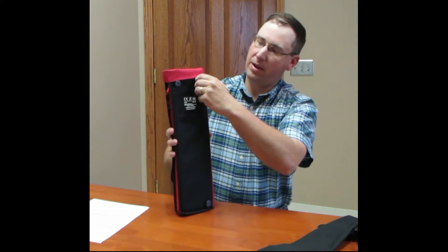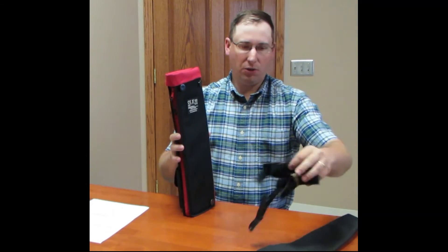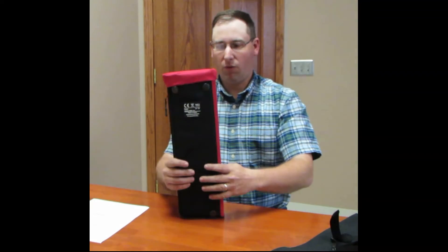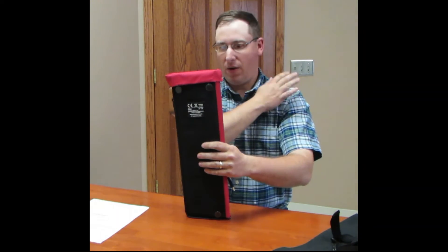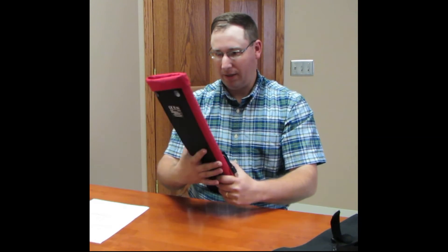On the back side, we have two really nice, well-reinforced buttons here that your shoulder harness straps will slide onto. You can adjust them as you see fit and as it's comfortable for you. For example, in a dairy situation where you've got recipient cows in headlocks, you can just go ahead and slide it over your shoulder and take it down the line with you and put embryos in.